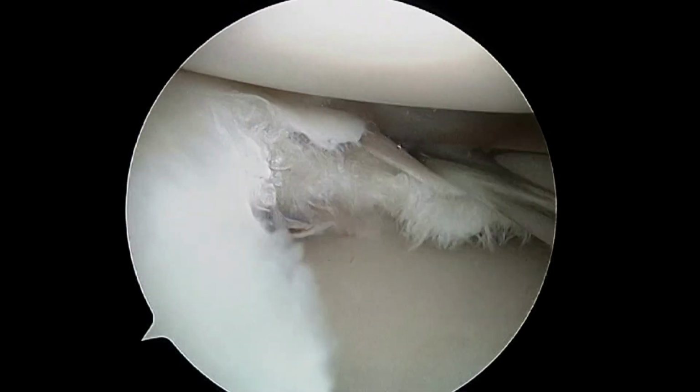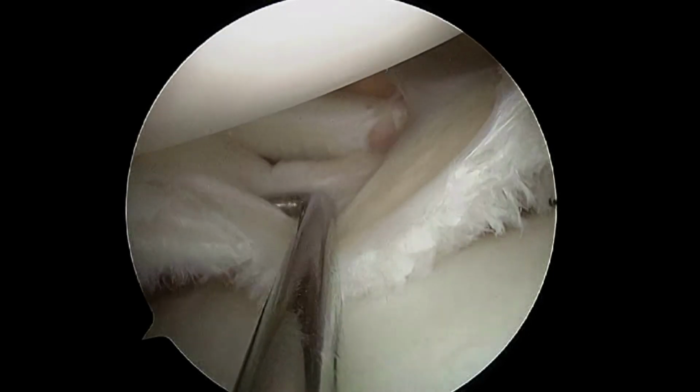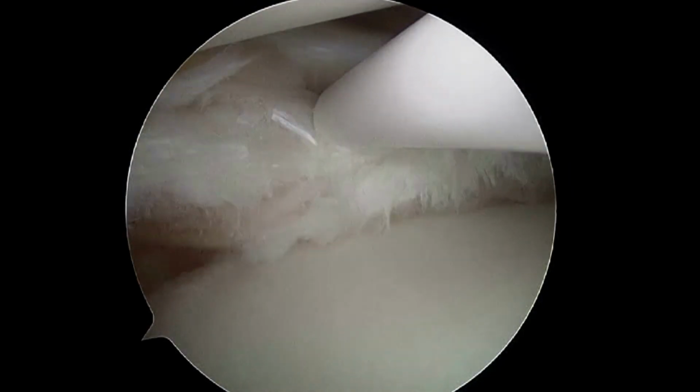On palpation, the meniscus body exhibits increased mobility and horizontal tears. The tissue quality also appears poor. Hence an all-inside repair is carried out.